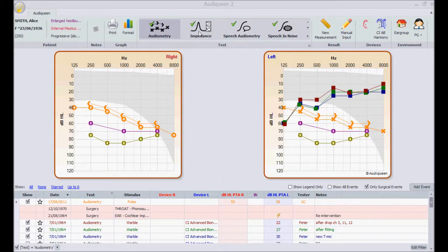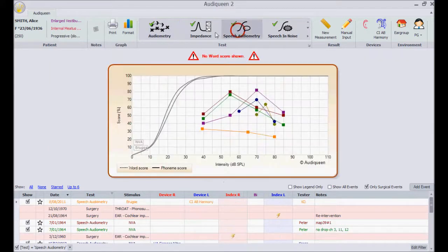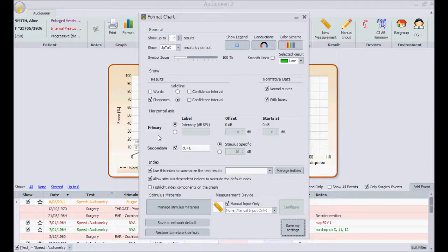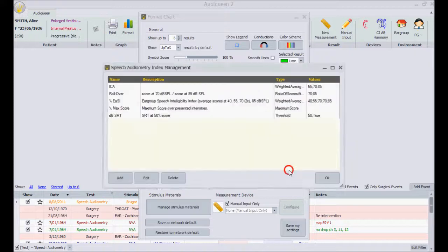Also for speech audiometry, most options are self-evident, or have already been explained in the overview video. Here also, indexes can be managed with administrator rights.